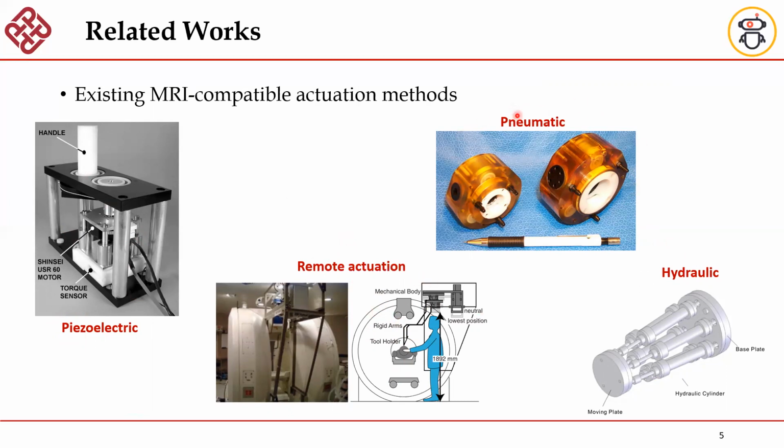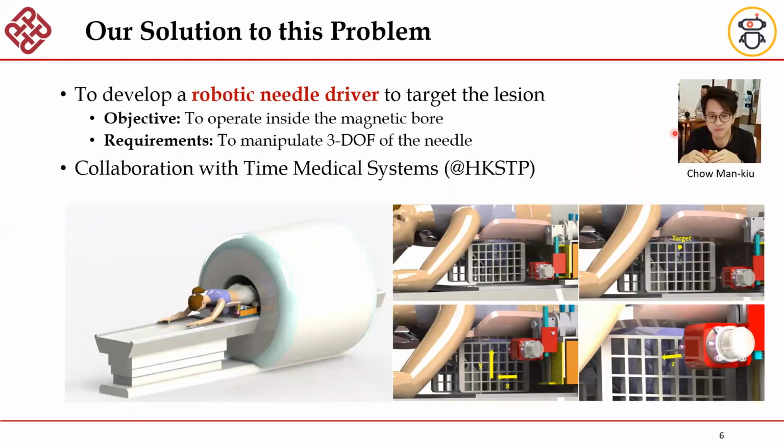We are following pneumatics in this paper because it's clean, magnetically compatible, and relatively easy to control. This is a project we had a couple of years ago. All this work was mostly developed by a research assistant I used to have here at PolyU. Our objective was to develop an entirely pneumatically driven mechanism that could drive this biopsy needle inside the tissues.